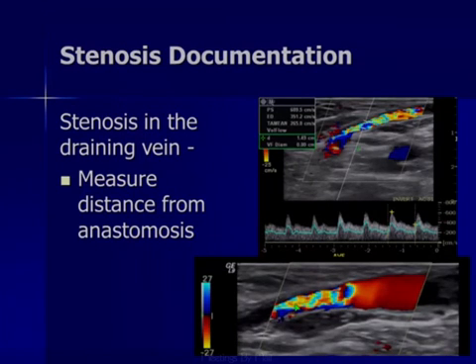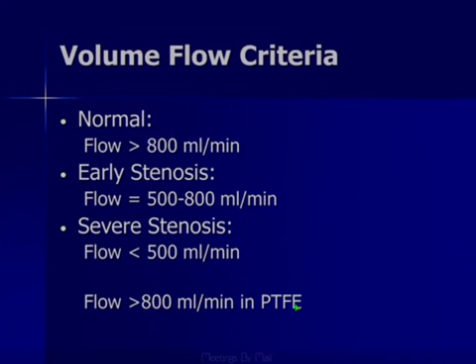Sometimes there's enough redundancy in the vein that they can do a primary procedure to fix this. Other times it may require something more extensive.